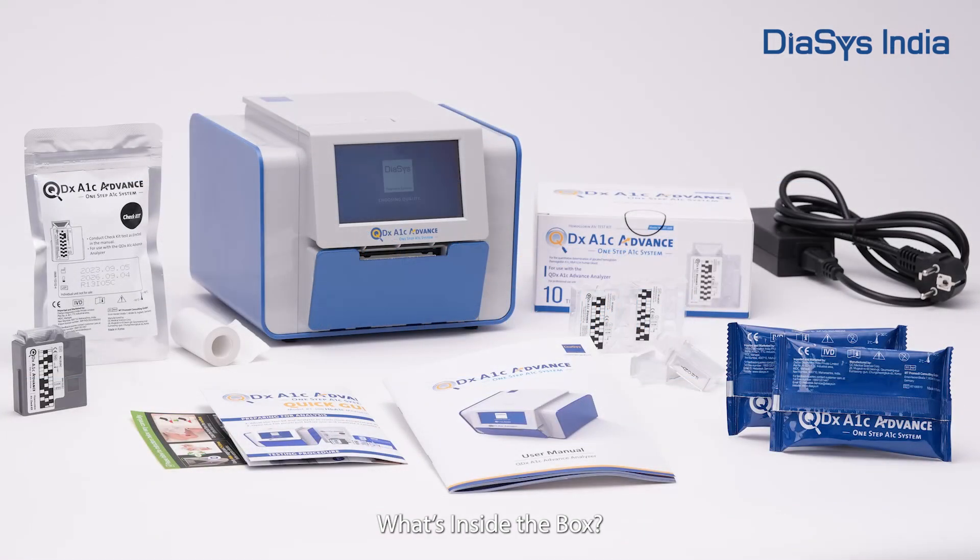What's inside the box? The QDX A1C Advance Analyzer, a check kit, a test kit, user manual, power cable, and printer paper roll.